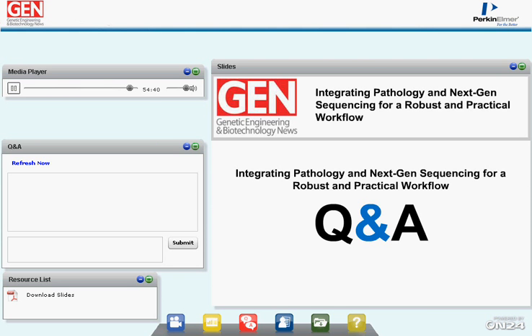The systems are simple enough to train. As Cliff showed you, you select an area of stroma, you select an area of tumor, and you hit go. And from that, you can then get a very reliable, reproducible number of tumor abundance. So these are the types of tools that we can teach a pathologist how to use, as opposed to replacing a pathologist. You still need that trained eye.